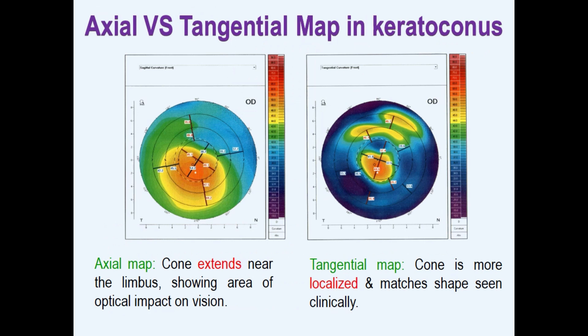For example, in this case of keratoconus, in the axial map the cone extends to the periphery, while in the tangential map the cone is more localized and matches its clinical appearance.